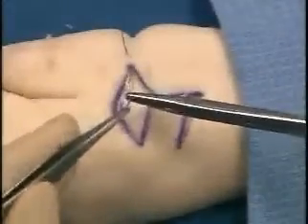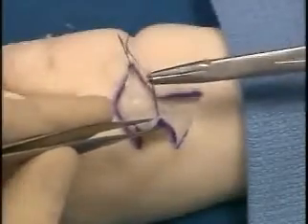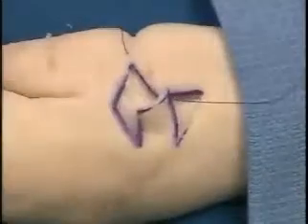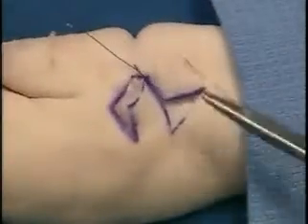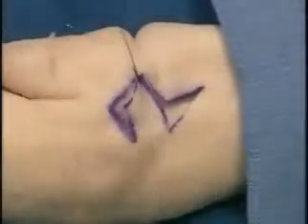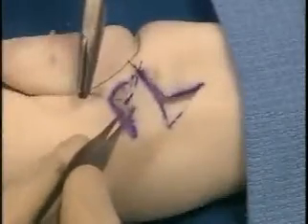The point of maximal tension of the flap here is seen with the first suture. All apices of the flap are then sewn. Here's the first suture at the point of maximal tension. It is at a corner. A corner stitch is not necessarily needed in every case, but you can see how nicely this flap is rotated into position to cover a defect.